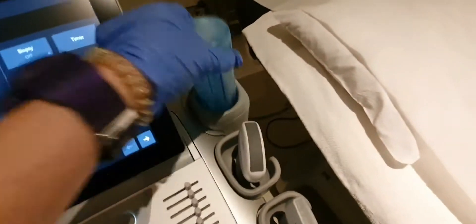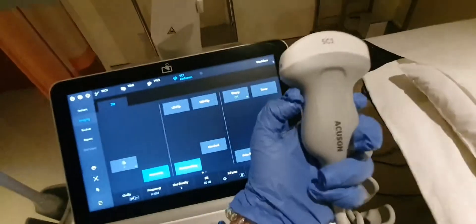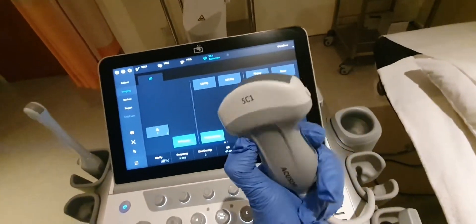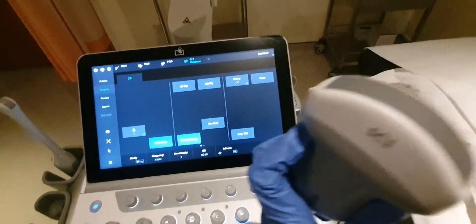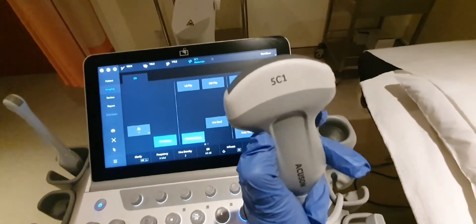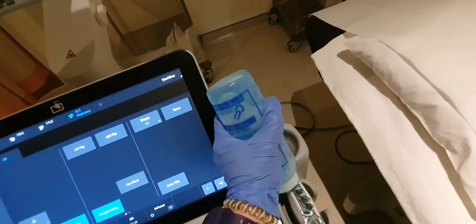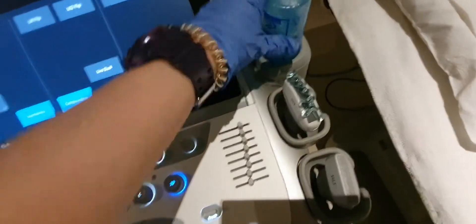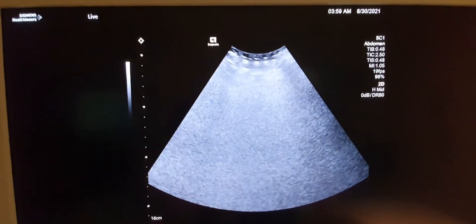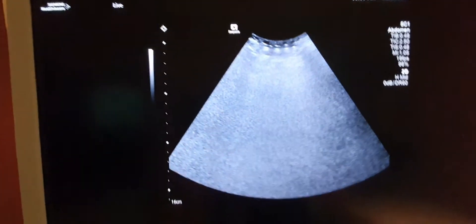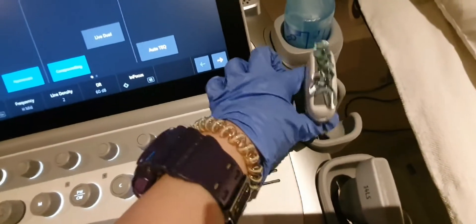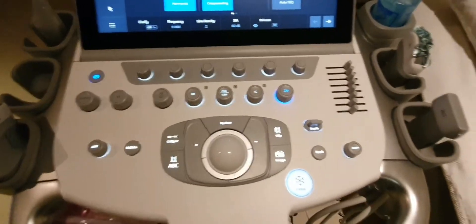Let's say we're going to do an abdominal ultrasound. First we need to put gel on the probe. This is the curvilinear probe — it's used for abdomen and general ultrasound examinations, and also for pelvic, KUB, and pregnancy ultrasound. We don't have an anatomical structure visible because there's no test patient, so I'm just going to show you how the technology works.